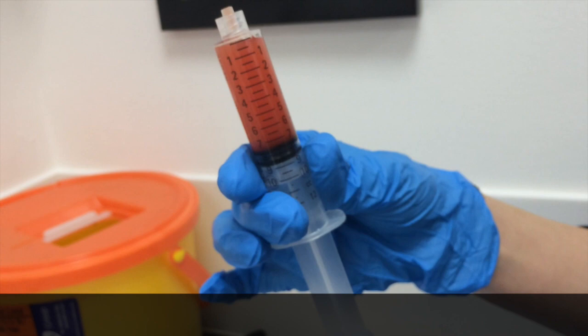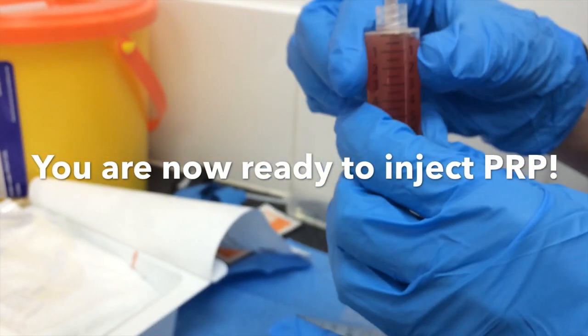Now you have it. So that's the platelet-rich plasma.